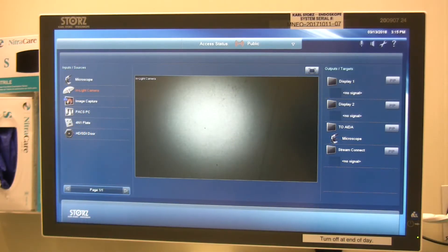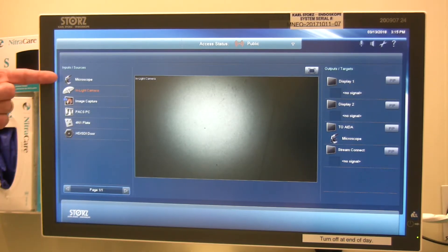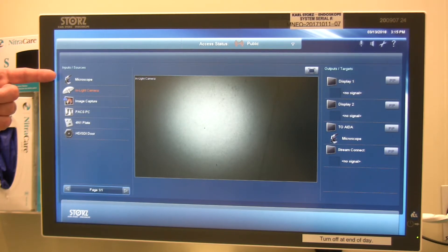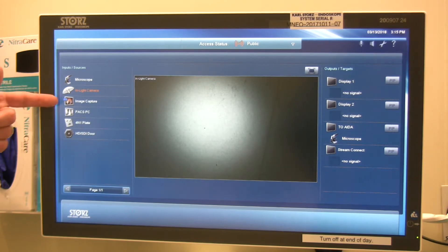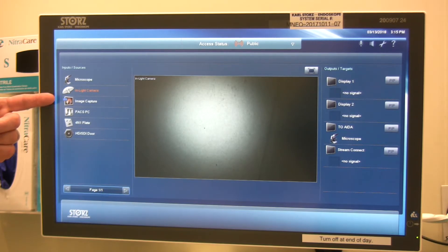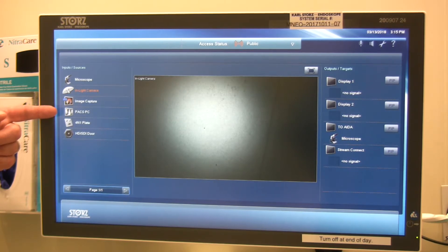Now we're going to talk more specifically about the video inputs along the left side of the screen. On the top, we have the microscope — in this room it's plugged into an HD-SDI wall plate and always connected, so we've labeled it microscope. Video source number two is the in-light camera, the camera in the surgical light. Input source number three is image capture, giving you a preview of what you're seeing on the AIDA at the touch panel. The fourth video source is the PACS PC, so we can take a source from the PC and send it to any one of the displays.